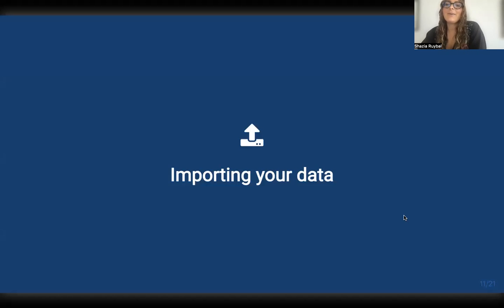Excellent. So moving on to now actually importing the data into the app. Based on the experience from the Molecular Hub, seems like this was quite easy, so very glad to hear. Now I'll take all of you through what that would entail when you do it on your own.